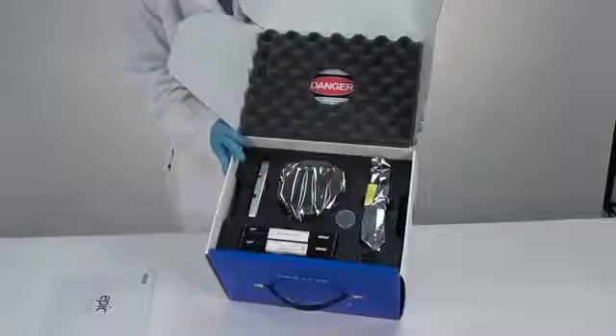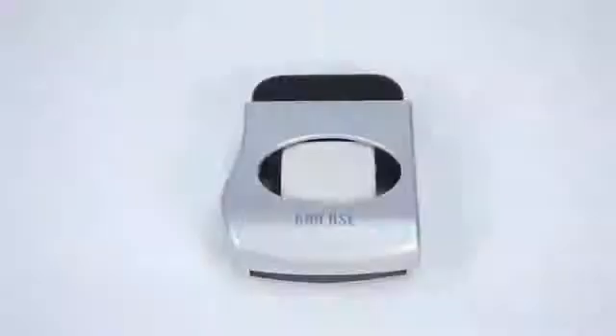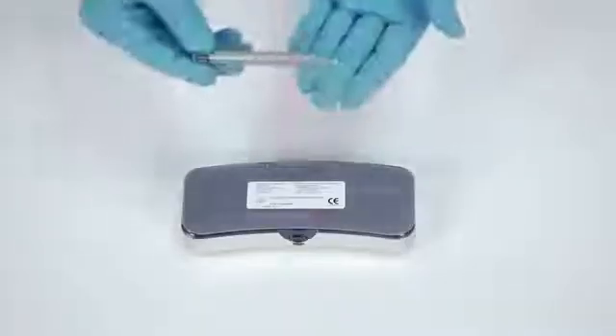The top layer within the EPIC box contains your EPIC laser console with the delivery system installed, foot switch, an extra set of AAA batteries for your foot switch, and the surgical handpiece and case.